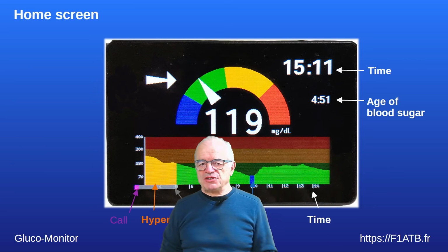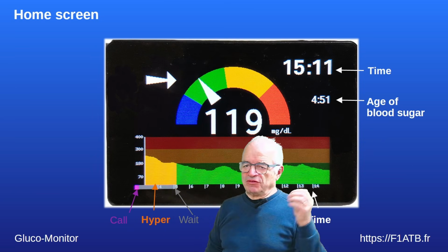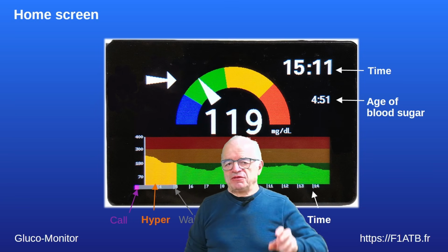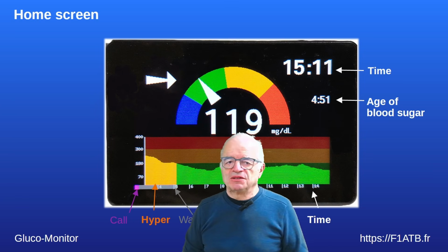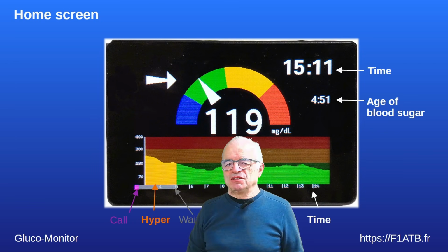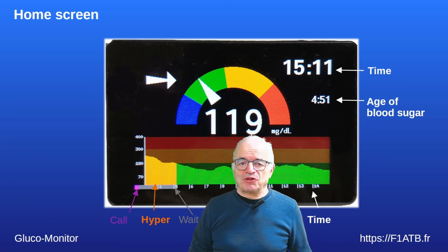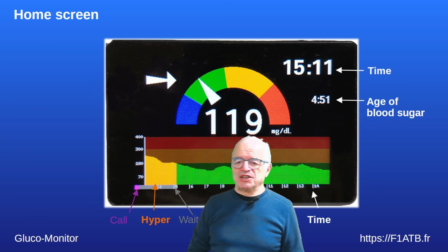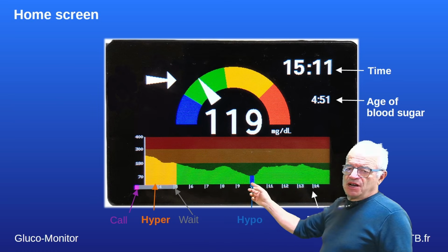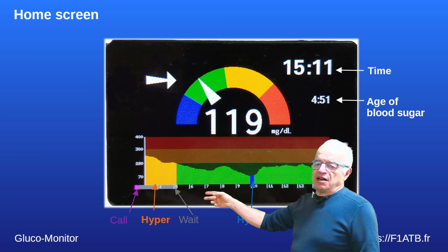If this age is more than 10 minutes, the value will be displayed in orange. If it's more than 15 minutes, the value will be displayed in red. And if it's more than 20 minutes, the system will completely restart, suspecting, for example, a problem with the Wi-Fi connection and so on.